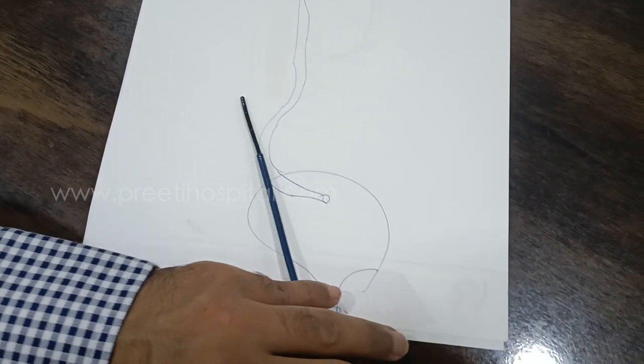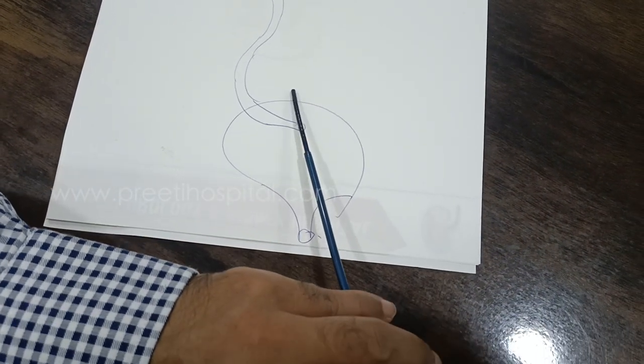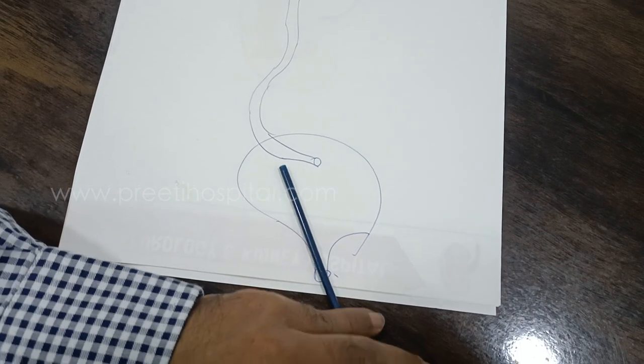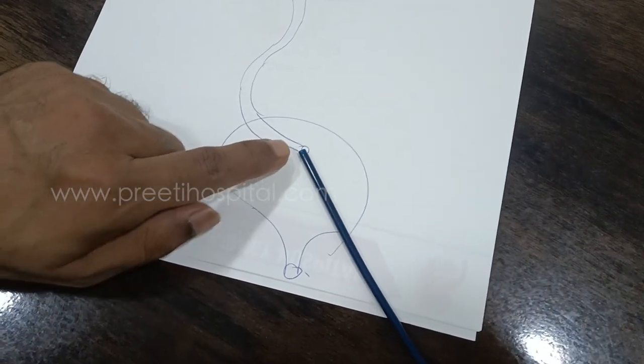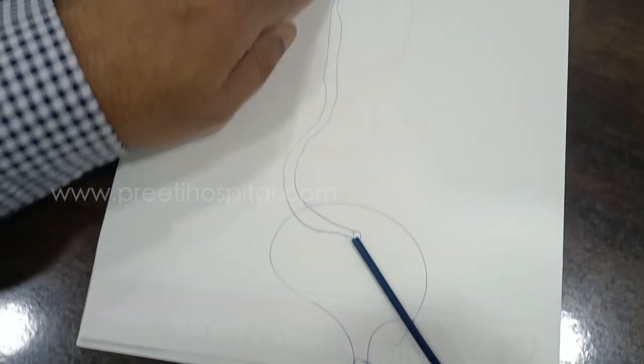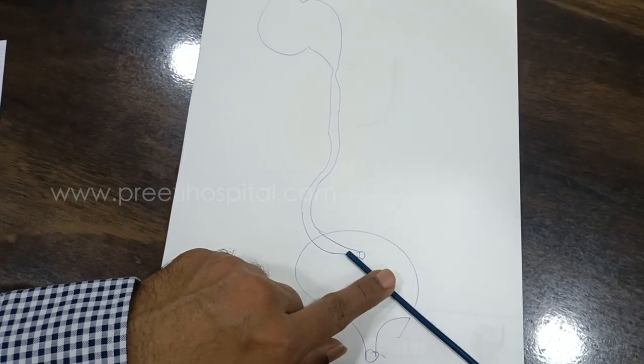Here we are sharing, this is the flexible scope coming like this. Normally, when you keep just at the entrance, whenever there is difficulty in passing the ureter, people try to do by just keeping here.